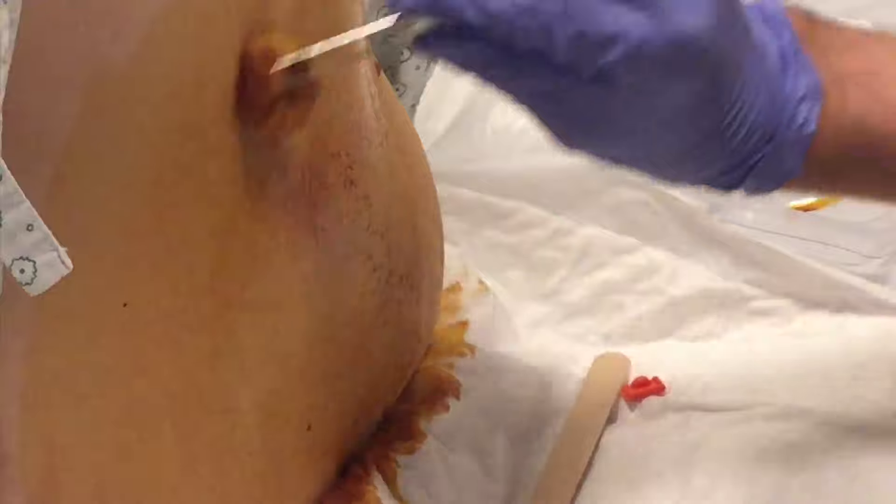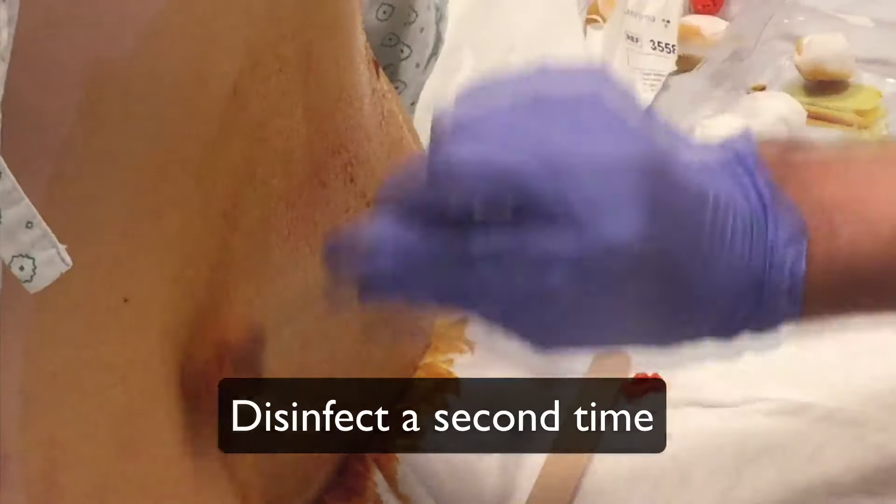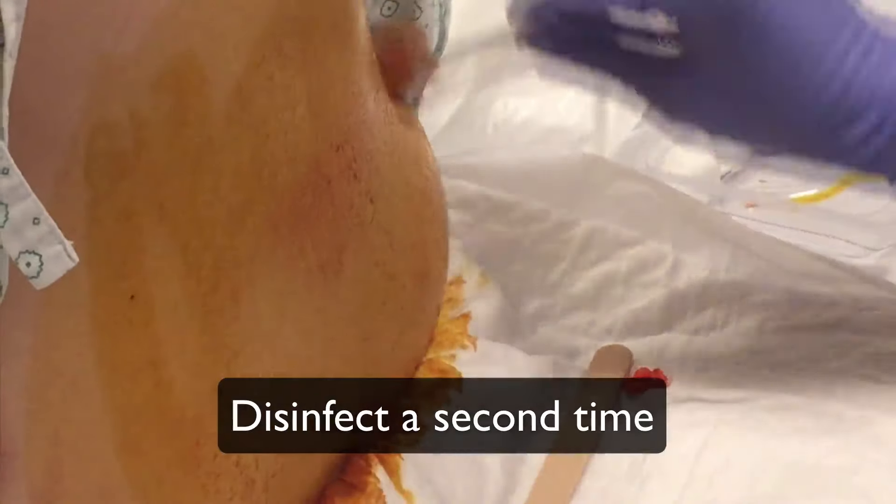You might want to disinfect the skin a second time. From now on, use sterile gloves.